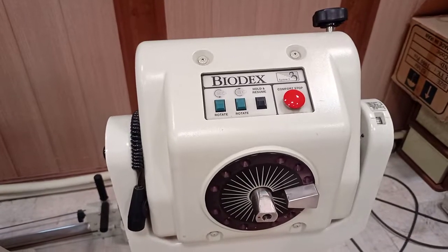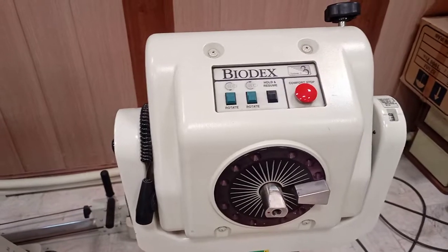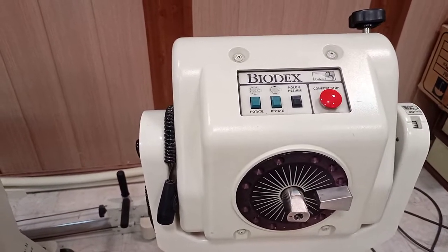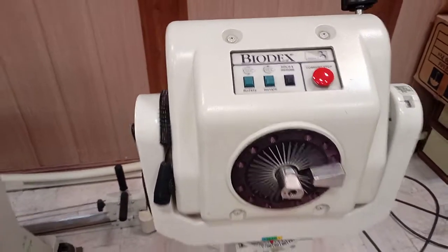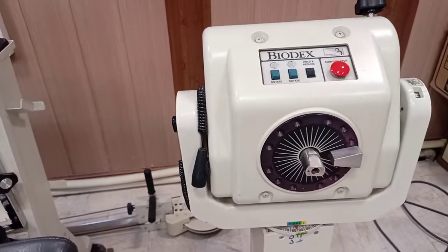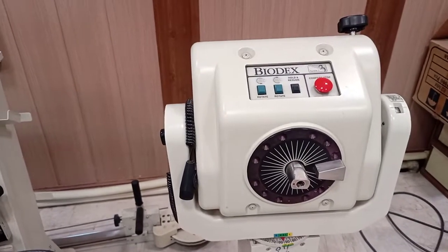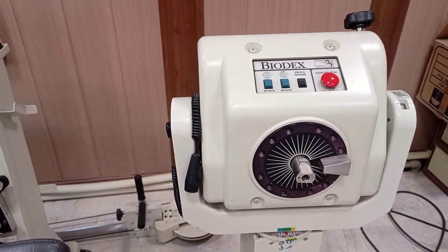Assalamu alaikum. Today we'll be discussing Biodex. This is Biodex System 3 and we are about to discuss the isokinetic system. This is basically an isokinetic system by Biodex. There are a lot of companies that manufacture isokinetic systems, so let me discuss briefly the parts of the Biodex system.